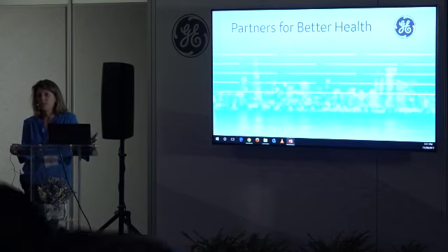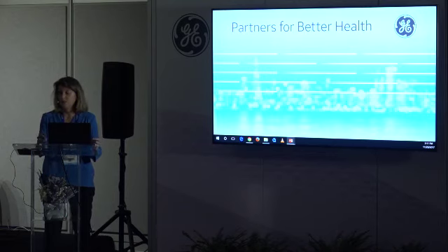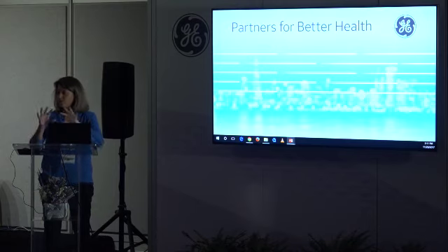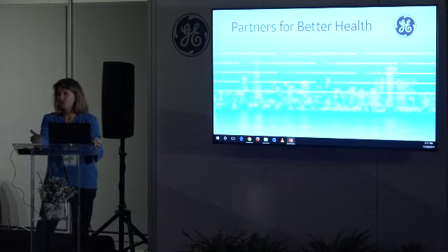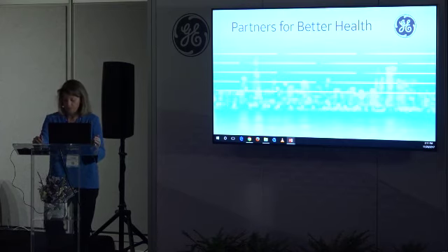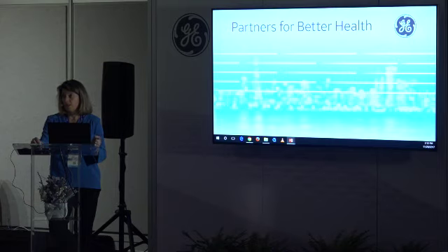To my knowledge, we had three. We started to do it routinely in 2012. And three shocks. Of course, you have to be organized because you know that it can occur. But as we are in a hospital, all the technologists have emergency resuscitation support for the shocks. How many exams, Corinne? You said three shocks, but how many? 450 over 5 years. More than 3,000 imaging acquisitions, three shocks. So one per thousand.